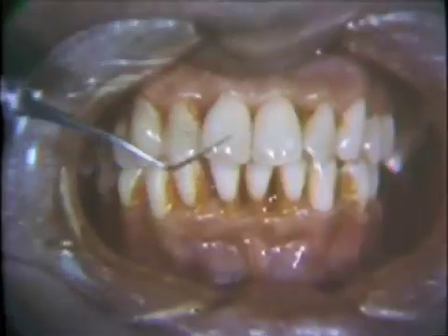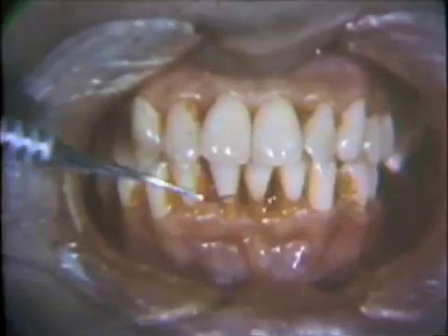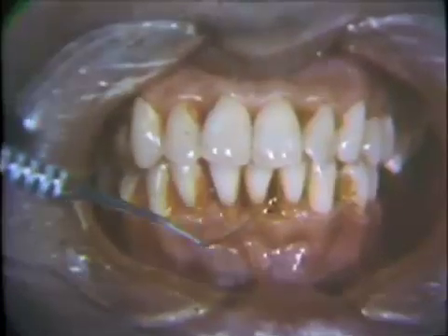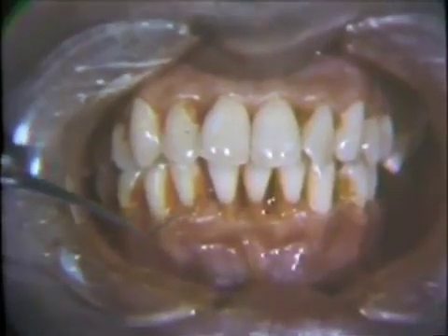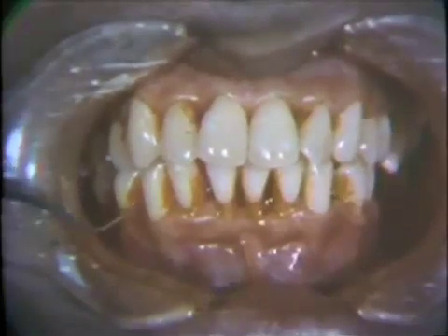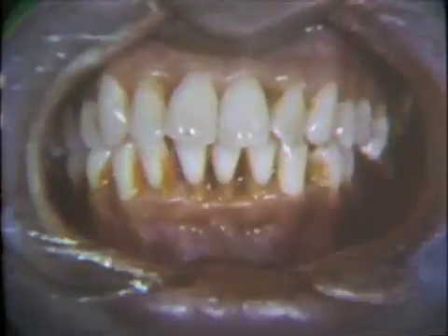Disclosing solution is again applied to check the effectiveness of the patient's oral hygiene. There is retained plaque interproximally in areas of exposed root surfaces. The patient, therefore, is given additional instruction in oral hygiene.